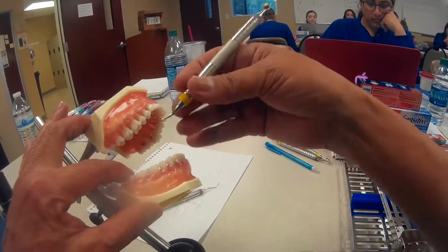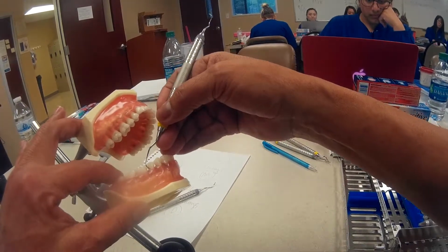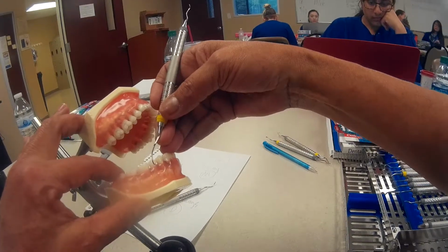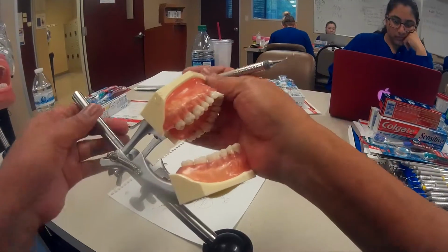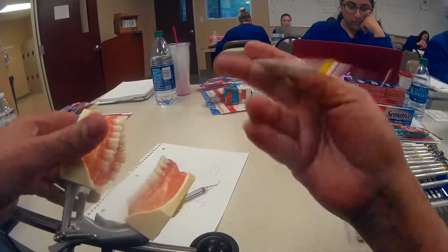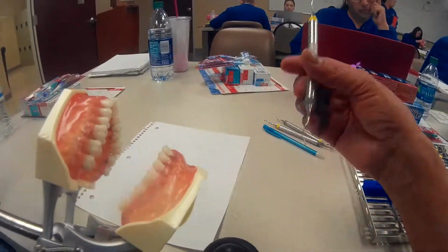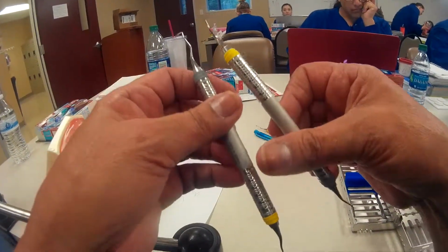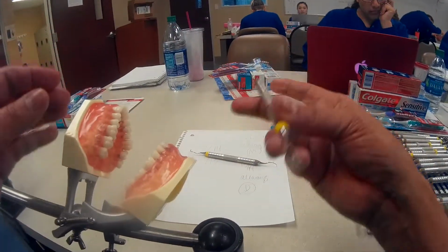Flip the end, go back here on this distal, the get ready zone again. Alright, now I'm going to do my small horizontal strokes, and I'm going to pivot and make my way around to the mesial. Okay, these are really beautiful instruments to use. They're, I guess, the essence of dental hygiene when you stop and think, because everybody really needs to learn how to use Gracey curettes. Gracey curettes are just really the foundation of periodontal instrumentation.